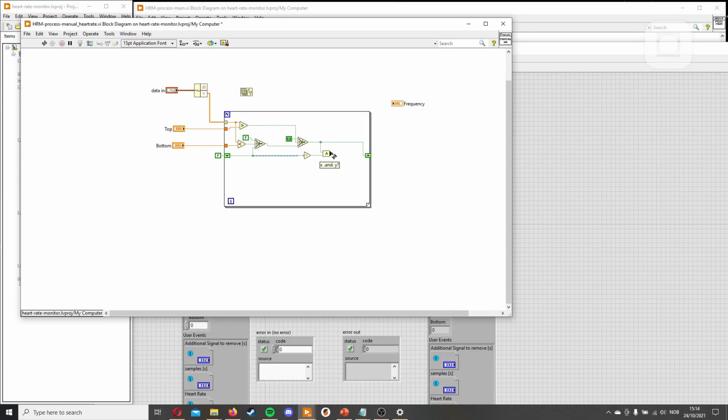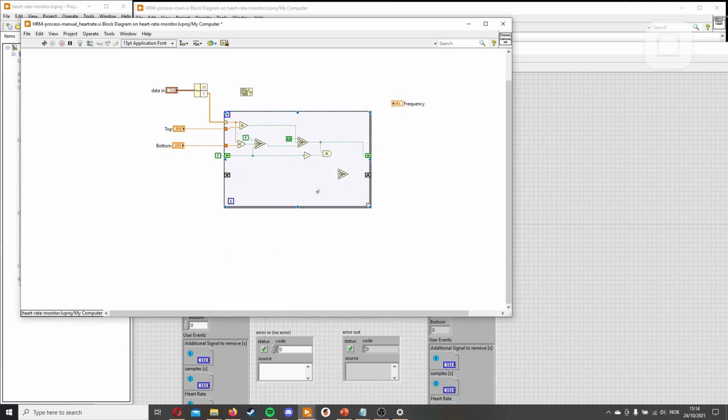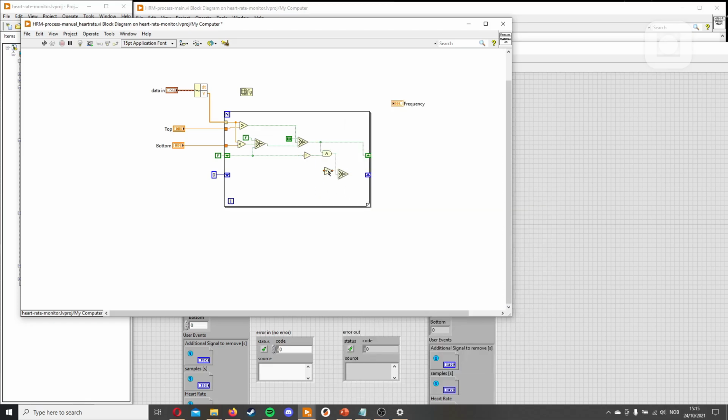Now we can enter when there has been a change. We also need to count this. And to do that, we'll just add another shift register, which is based on this, because as we know, this will only be true if there has been a transition. And we can add a value, 0 here, so it starts every time it's used at 0. But when it's true, it adds a value here. And when it's false, it will not add anything.